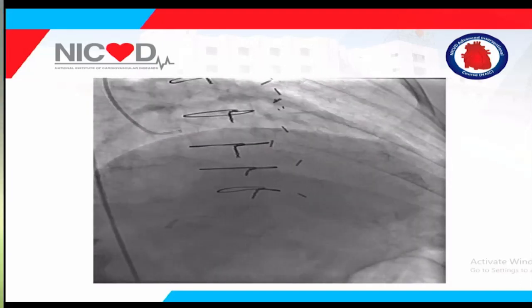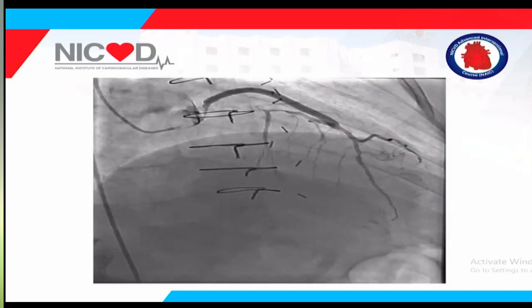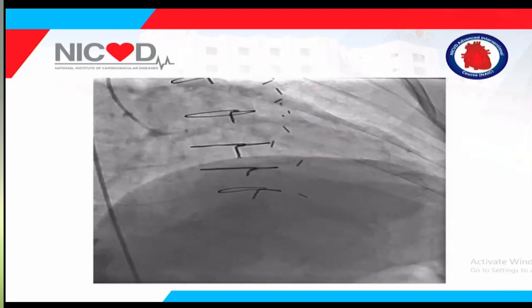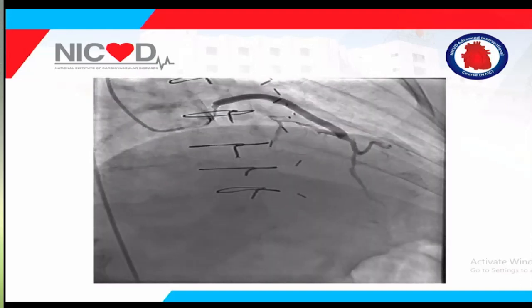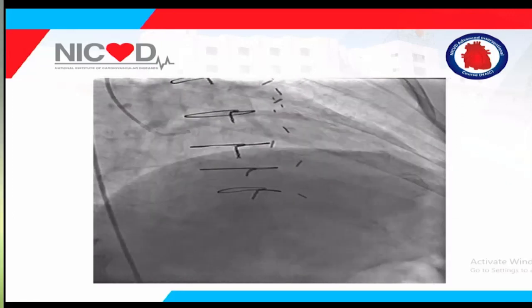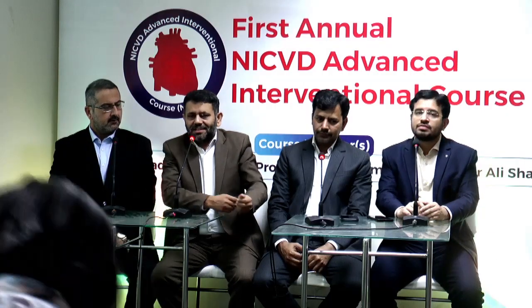So my comment will be that we should refer it to the heart team and let the surgeon decide, so the patient has the option of both. Most likely it will go for PCI of the SVG to ostial SVG. What about Dr. Gulzar? What are your comments?